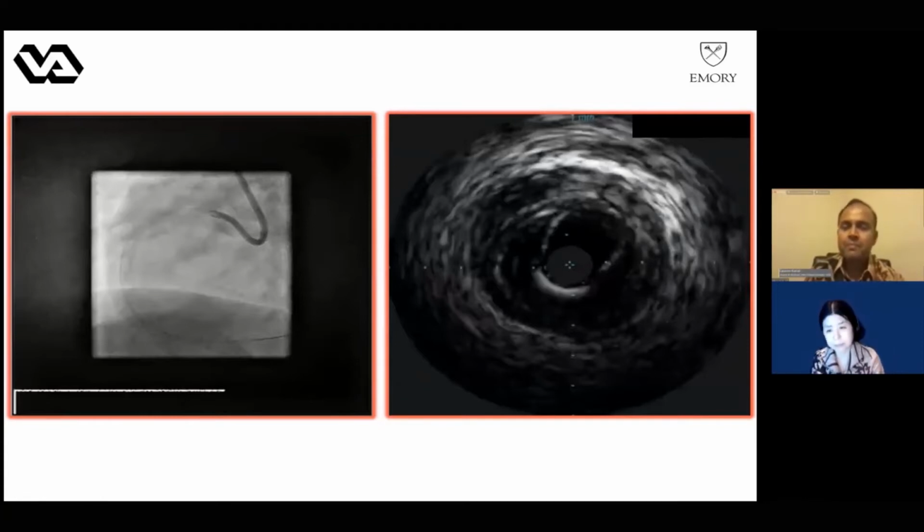Typically, the intramural hematoma is hyperintense and helmet shaped, pushing into the lumen. And the importance of this case was that it extended behind the stent, which we can recognize by the dark area, which could be blood or contrast, extending to the outside of the stent, close to the ostium. So now it has to be covered, and that's explaining what we see in the angio.